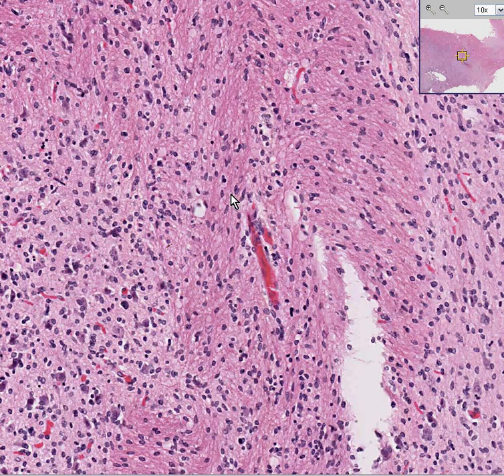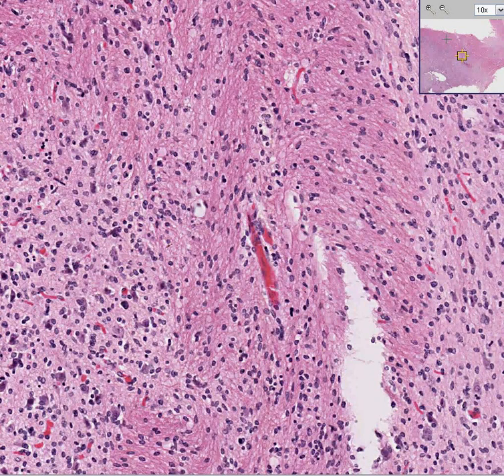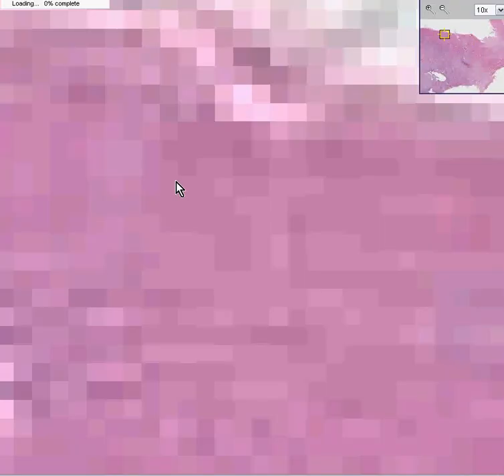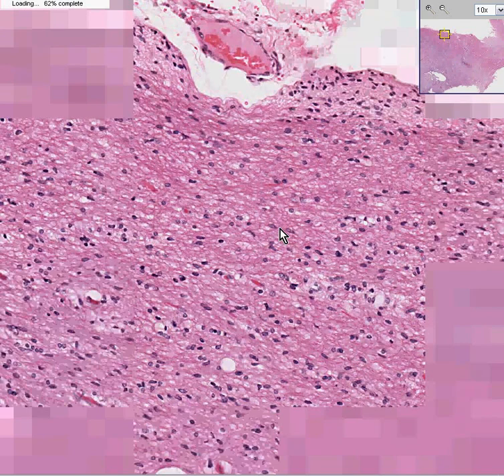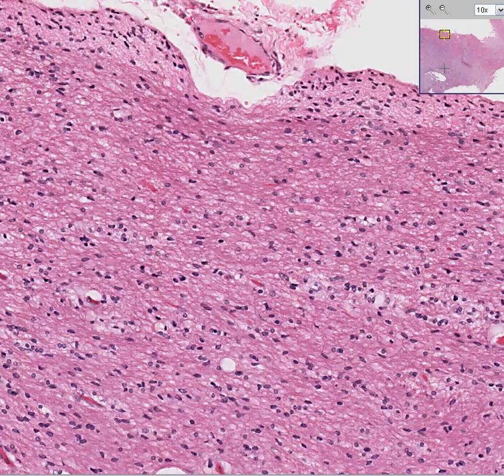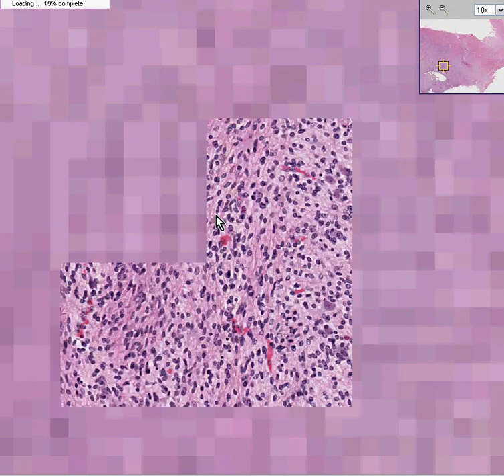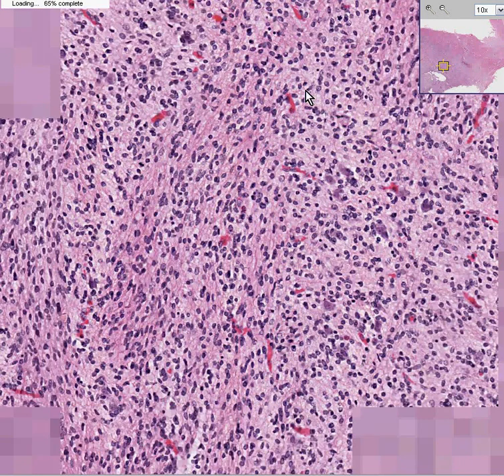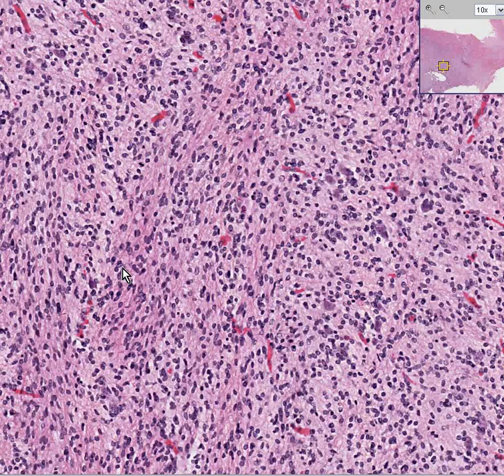Here is almost like a tract of normal or gliotic brain tissue. Here is the glioma — you could see it's very poorly defined. Now I'm going to go to a classical normal area up here: you could see a cerebral blood vessel, some normal-looking brain tissue, although there is an increase in glial cells, possibly reactive. And now going down to the area that looks solidly tumor — 99% of these cells are neoplastic glial cells, with only some little residual tracks of brain. That's why this tumor looked very poorly delineated, both radiologically on MRI and on the gross specimen — because it is.